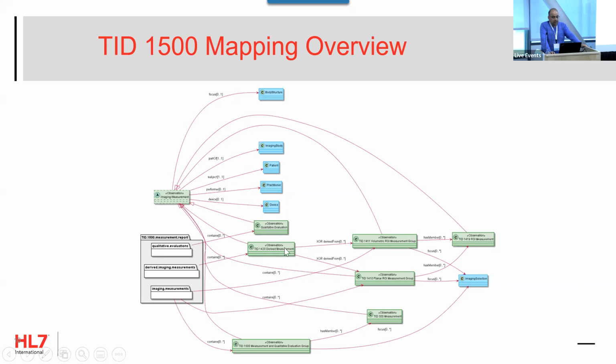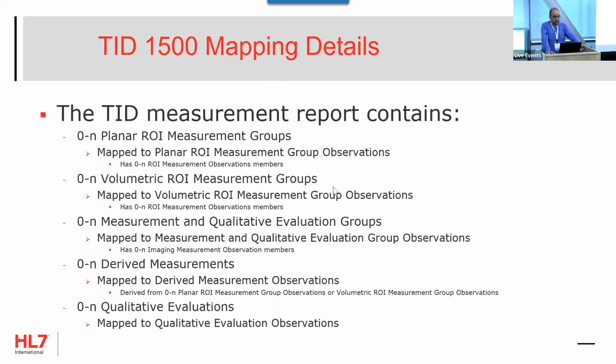But the different measurements, as I said, can include ROI measurements and volumetric measurements, and it's shown here, even though it's not implemented yet, the imaging selection aspect, because usually when you want to show the radiologist that you are deriving certain parameters, that means you need to specify a range of values.